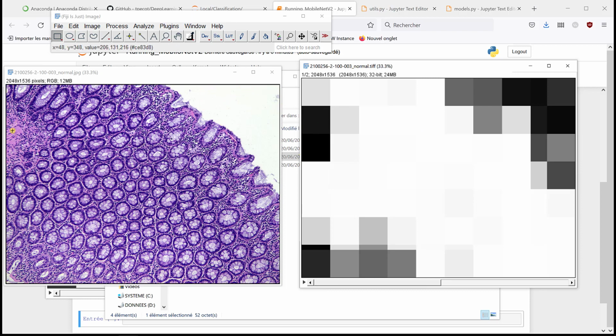And here, which seems to be muscles, it shouldn't be the case. But by doing that, it's interesting, you start to do some segmentation as well: which tiles are closer to normal tissue, which tiles are closer to adenocarcinoma tissue.